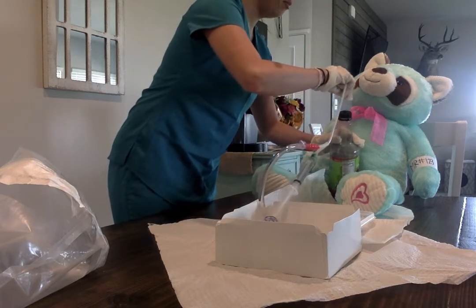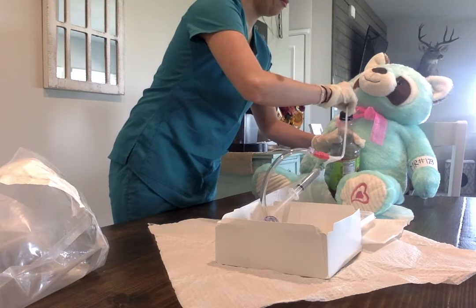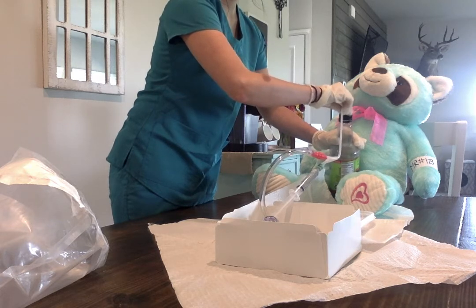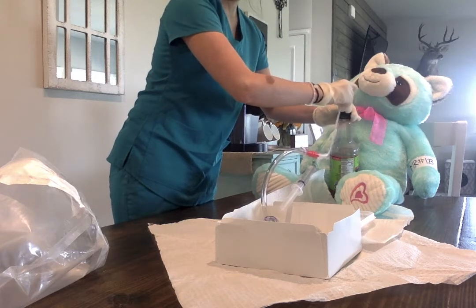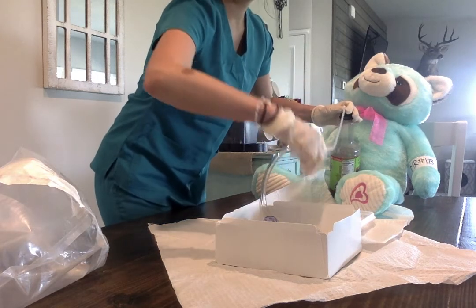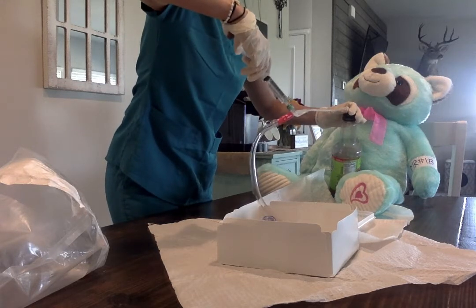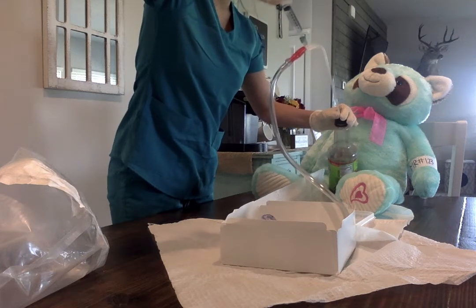Alrighty, take a big deep breath for me. Okay. And I'm just going to hold that there. And I'm going to inflate the balloon in there with 10 milliliters of water. Which I might have to come above.